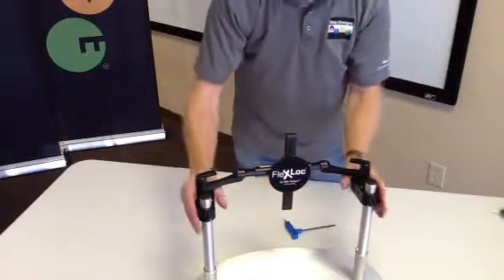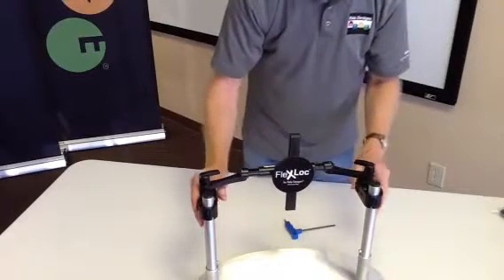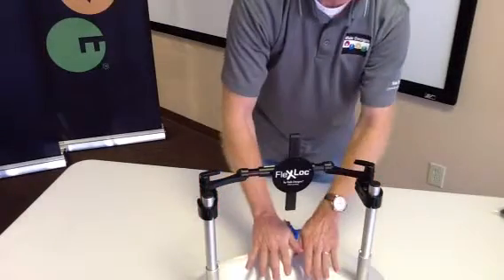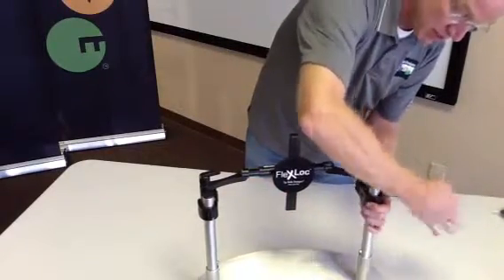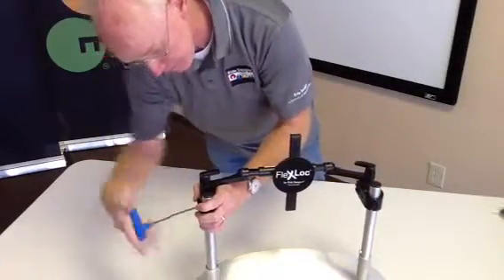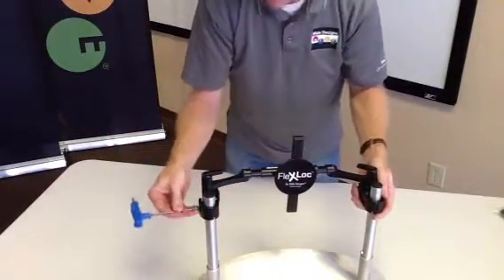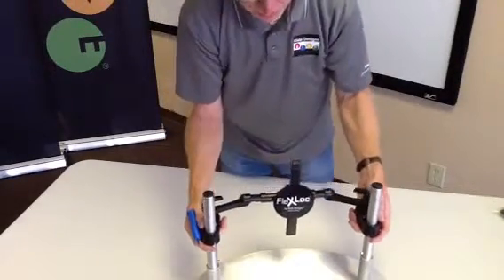At this point we've got the flex lock installed on the chair. Typically what I'm going to do first is adjust my back height to get an appropriate relationship to my cushion. Two mechanisms for that: simply loosening your clamps and repositioning the flex lock on the canes to the height desired.